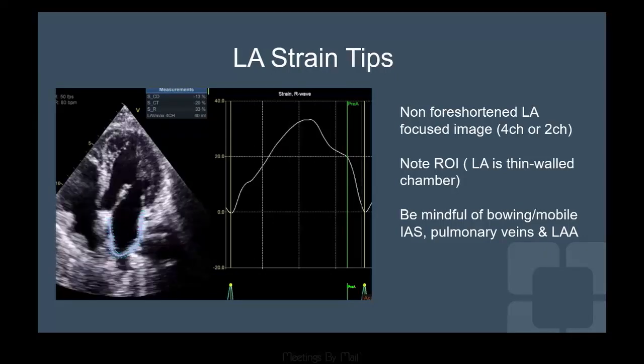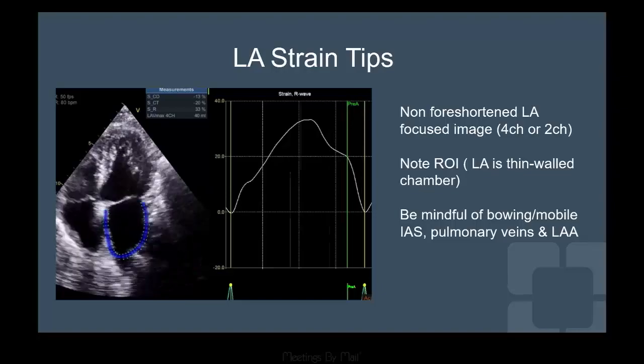So those of you who've done pulmonary vein flow for years, let me ask Partho, do you think LA reservoir strain is going to be more accepted in most labs, or is that just another thing to do?